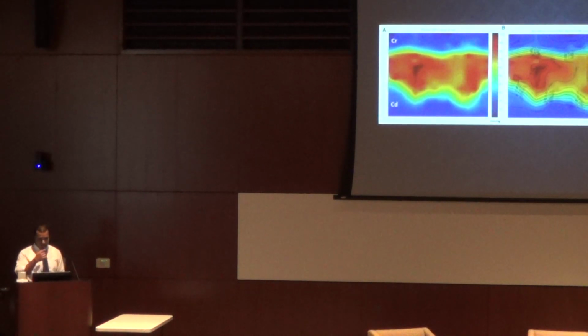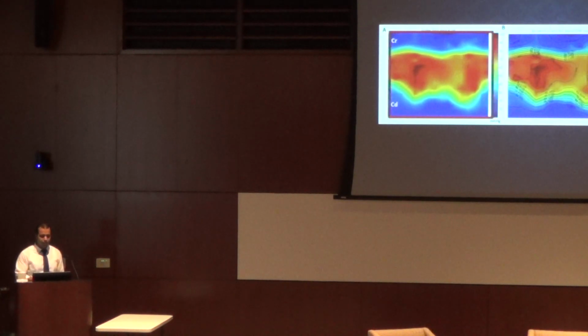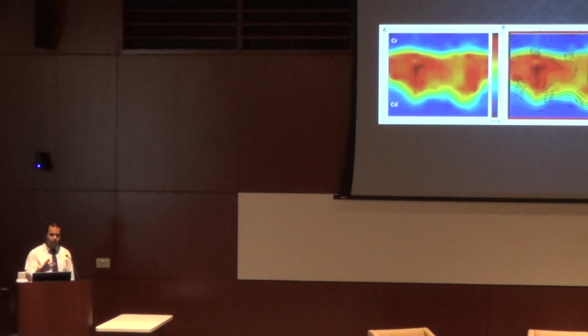And the third one is the high pressure zone area, okay? So if you have, this is an interpolated image of a resting person. And now, if you use a contouring algorithm to extract the isocontours. Isocontours are lines of similar intensity of this image.